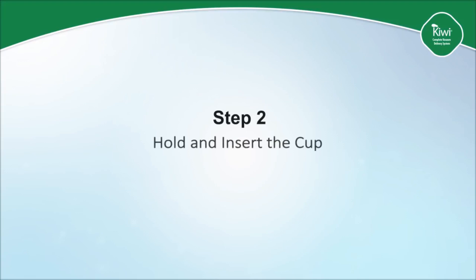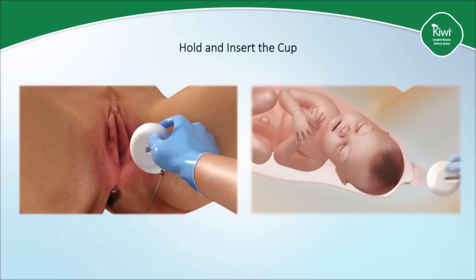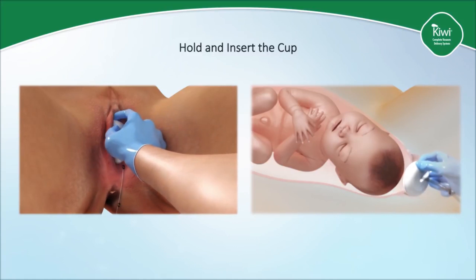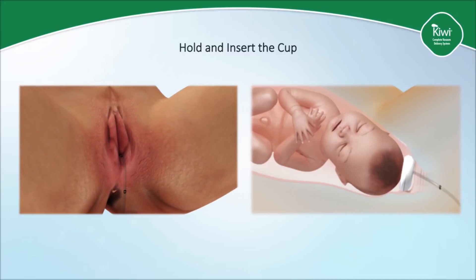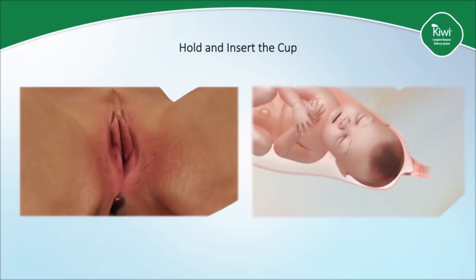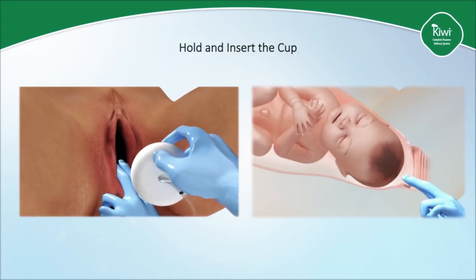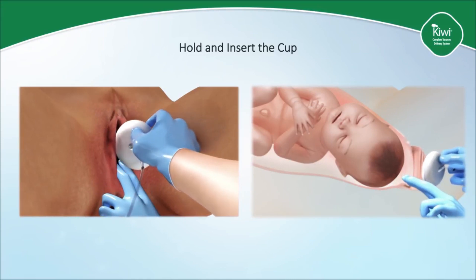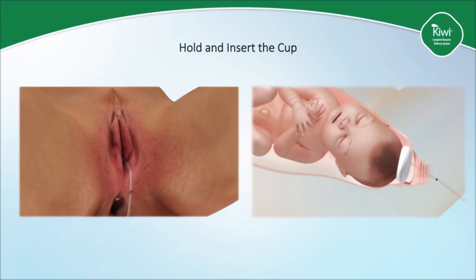Step two is to hold and insert the cup. The clinician holds the cup on its side, ensuring as low a profile as possible, with the thumb on the tube in the groove on the backside of the cup and the index finger on the edge of the cup. One or two fingers on the other hand is used to retract the perineum if necessary while the cup is placed gently against the fetal head. At that point the fingers are removed from the vagina and the clinician lets go of the handle to allow the stem to rest on the perineum naturally.